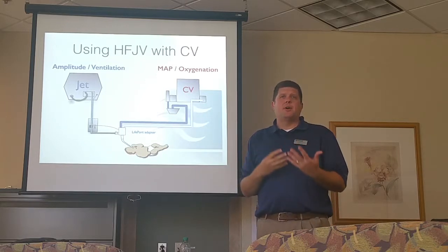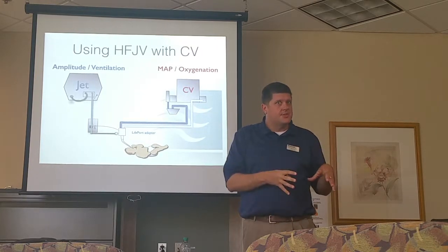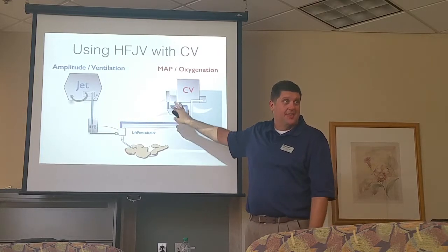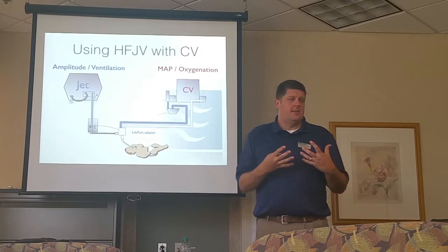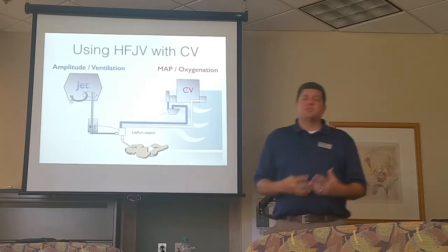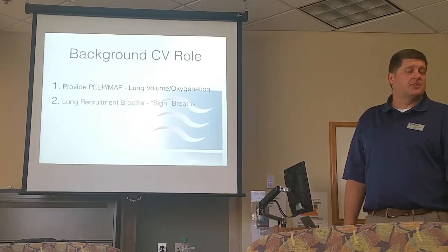Are there times where they cross over a little bit? Yeah, sure. If I have a high CO2 because I have atelectasis, I can go up on the jet all I want, it's not going to make a difference. I need to correct the atelectasis first, and then my CO2 will follow. But overall, the thing to simplify is to look at it this way: the jet is just your chest wiggle. It's the primary control for CO2. Let the conventional ventilator provide your oxygenation.